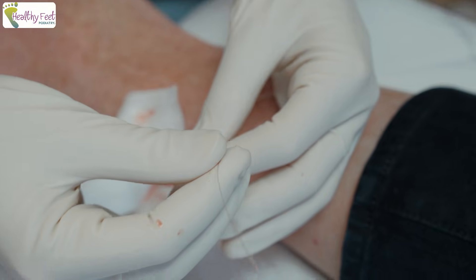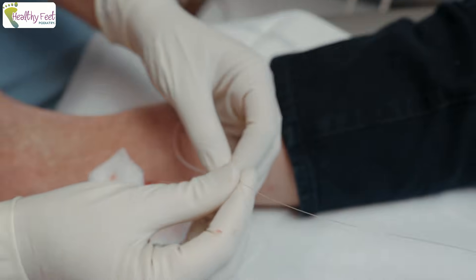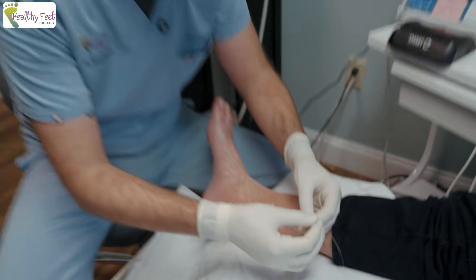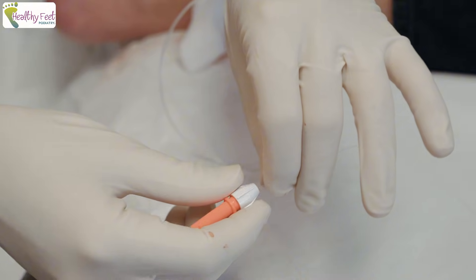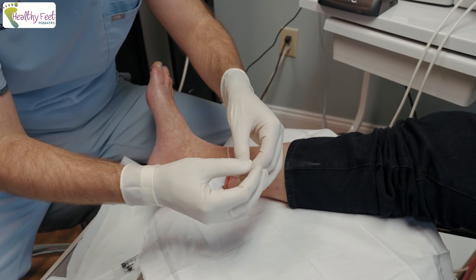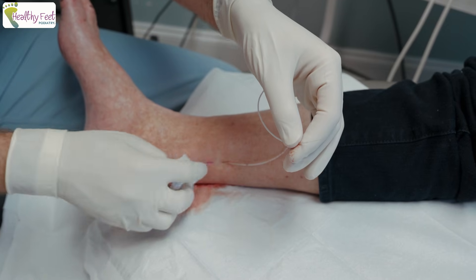This is the wire for the lead that we're putting in — it's super tiny. The benefits of this are specifically for people who have diabetic neuropathy. I use it on patients who have just chronic pain in their foot — it's a good way to really squash out the symptoms. I like it for those chronic issues. Worst case is when you take this lead out, you're done — it's a tiny little incision.